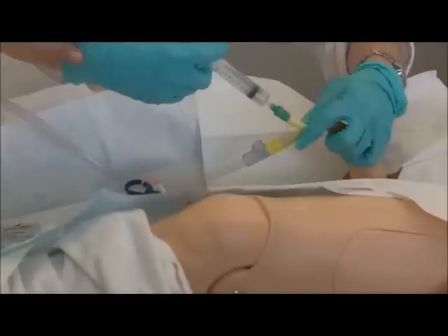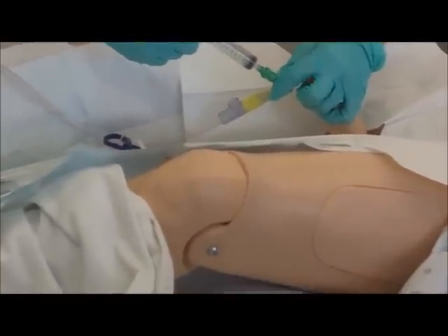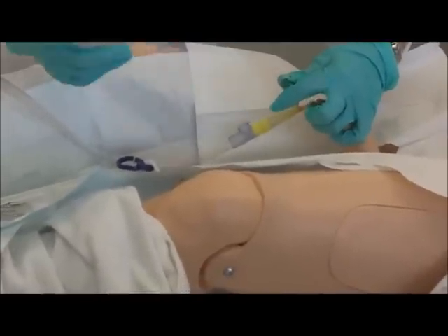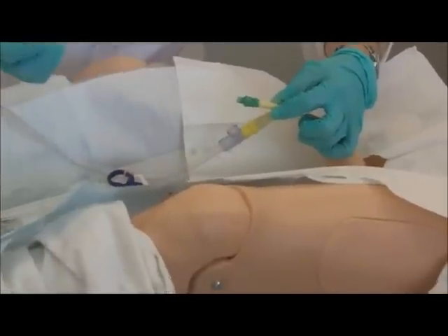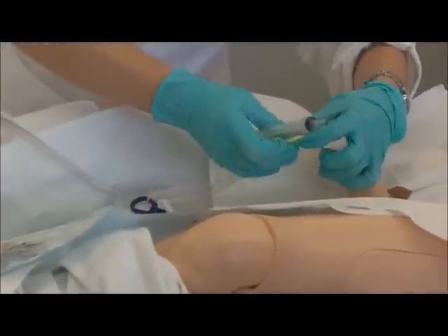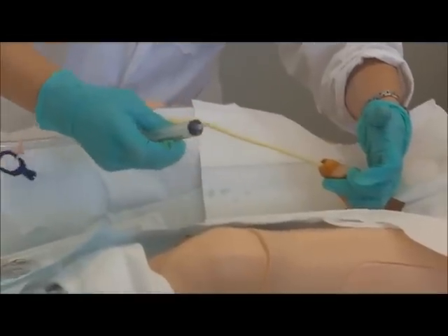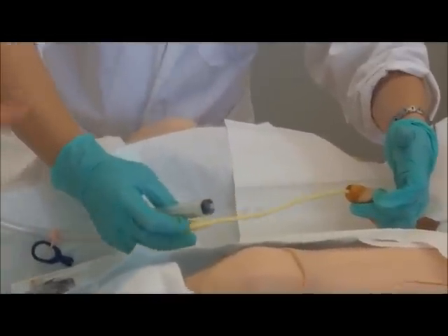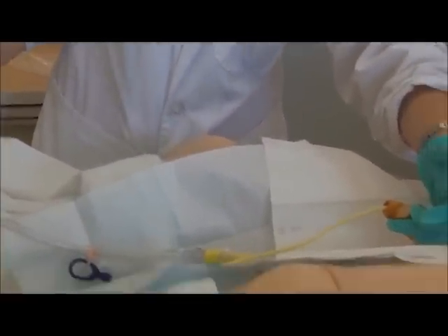Okay, push it in again. And you hold here, and with that hand now unscrew it or pull it off. Take it off — the syringe? Okay. Now you're done. Now let it go. Now pull the catheter back. Keep on going to feel resistance. Now, okay. So now you're done. You can throw that in here. Throw your syringe wherever you want because your sterile technique is completely over.